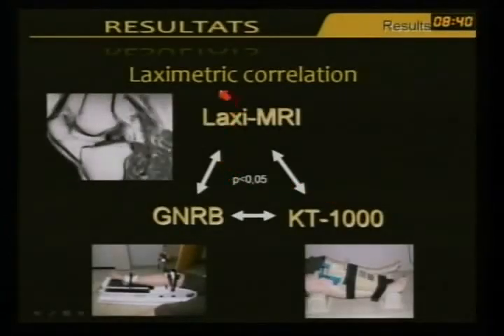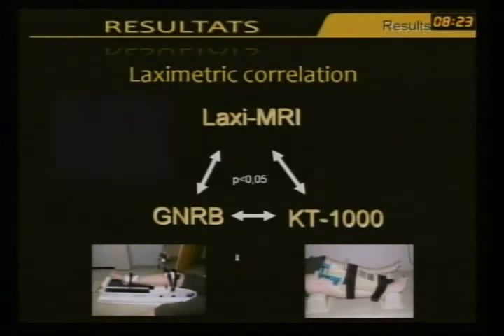So we did a correlation between the video analysis of the ACL remnant and the objective laximetry using the KT1000 and this device, which is called the GNRB.